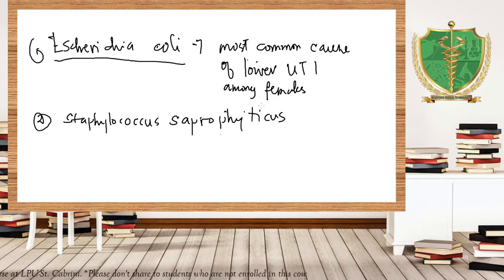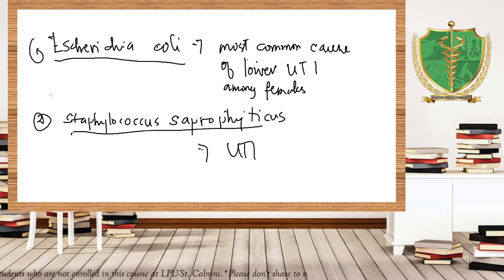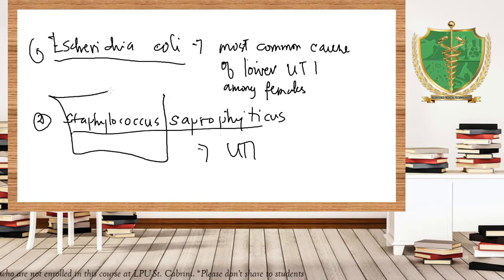Okay. So that is Staphylococcus saprophyticus. Okay. This is the most common cause of UTI from the Staphylococcus family. Okay. From the Staphylococcus family.